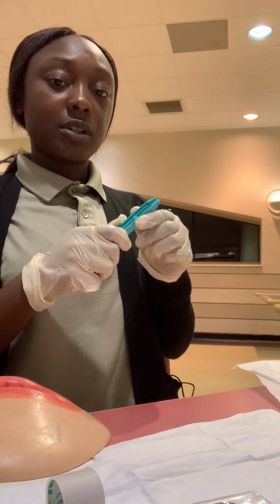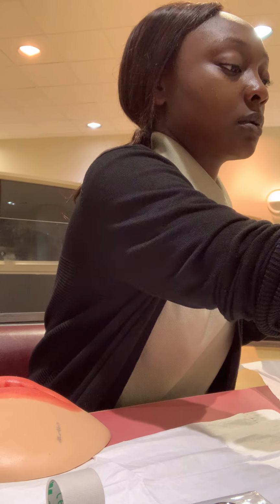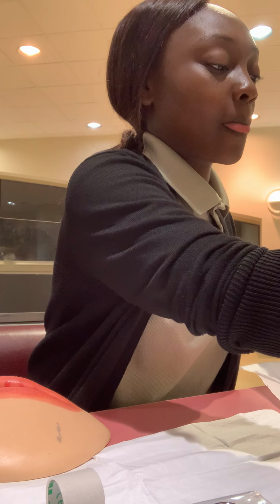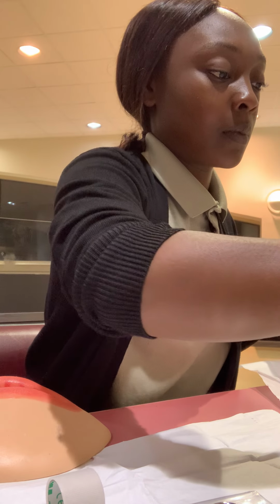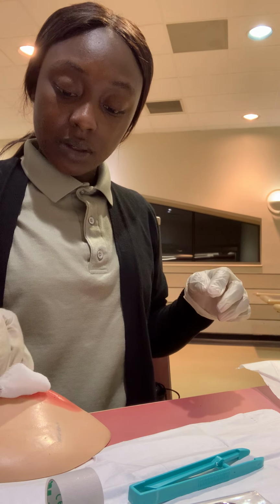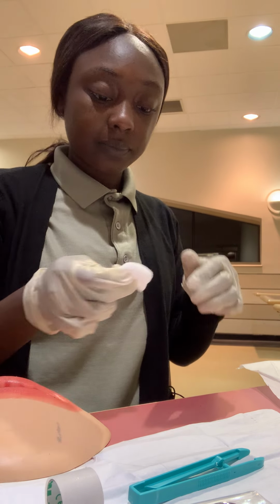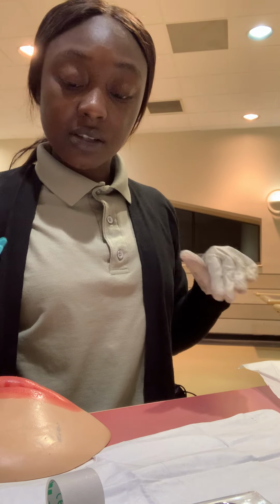Okay. Next, I am going to take my forceps and take one to dry, since we want to dry it. We are going to go from center to out, center to out. Next, and my gloves did not touch the wound.